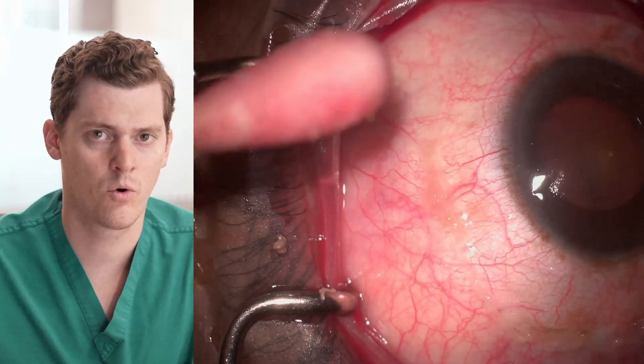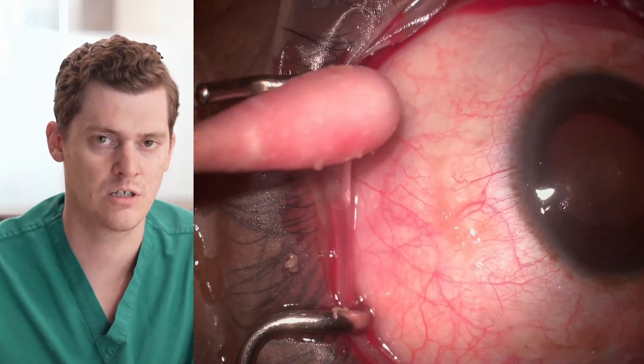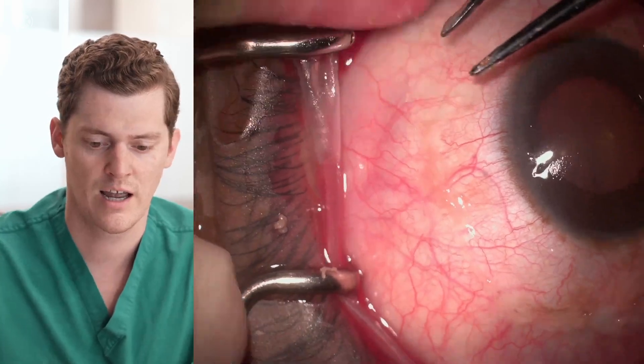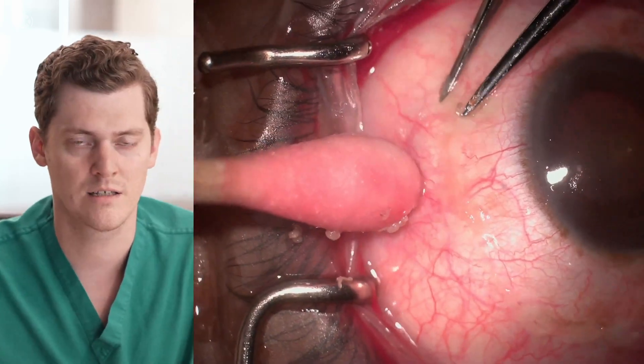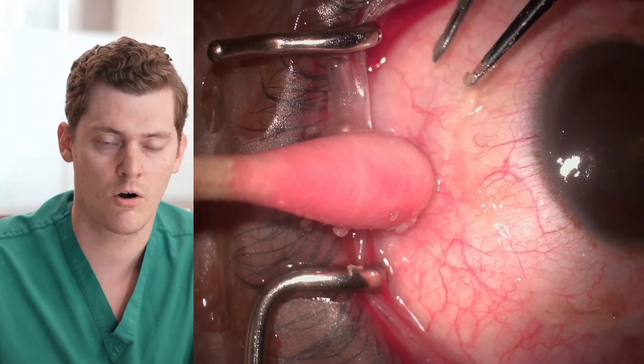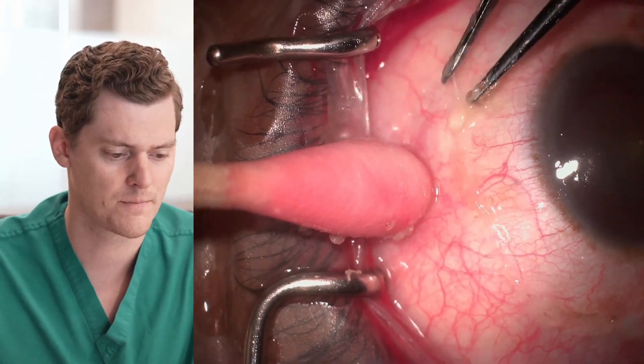This is our technique for how we like to surgically manage conjunctival chalasis. As you can see in this unedited video, it's taken about three minutes to effectively treat all quadrants for this patient. Thanks for joining us as we go over this approach — we're not having to spend a long time in the OR, we're not having to use sutures, glue, or amniotic membrane. It's simply cauterizing multiple quadrants and improving the patient's symptoms. Thanks for joining us.